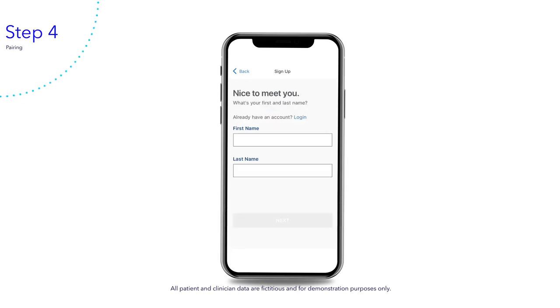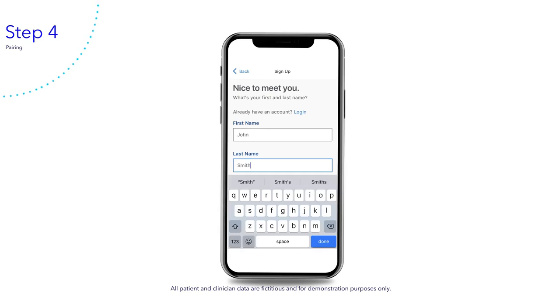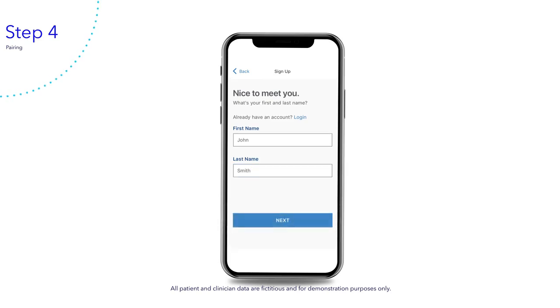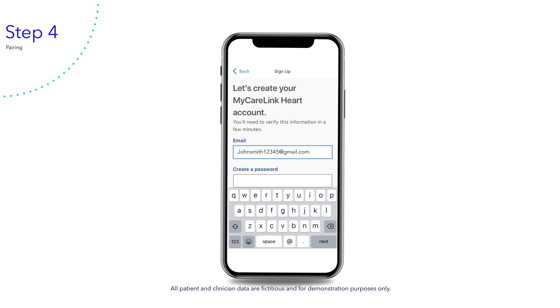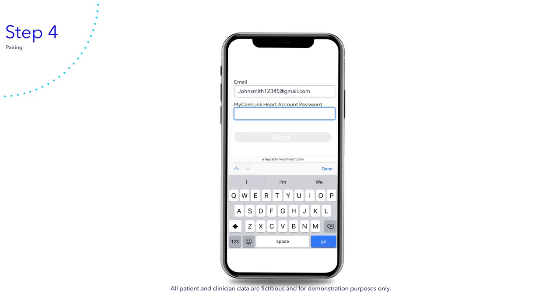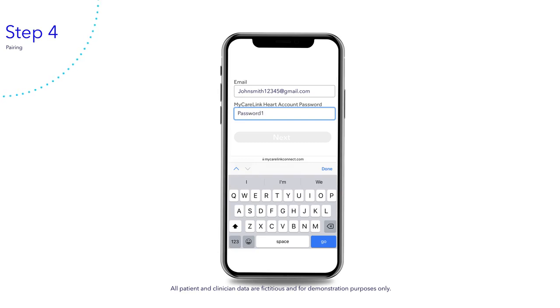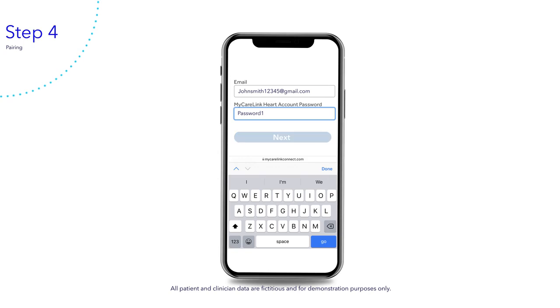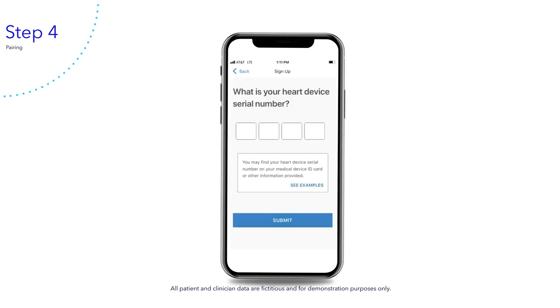It's time to set up your account. Enter your first and last name, then tap next. Enter an email that you or your caregiver can access — please write this email down, as you will need it to complete this process. Then create a password. Please write this password down exactly as you typed it, including any capitalized letters. Now tap next. Enter your heart device serial number found on your medical device ID card, then tap submit.